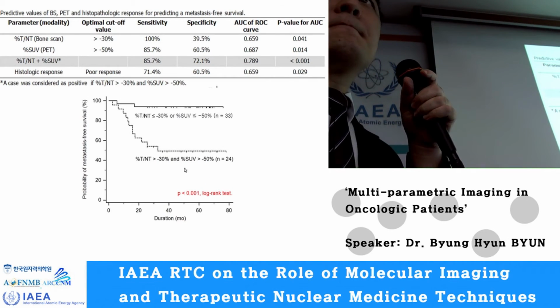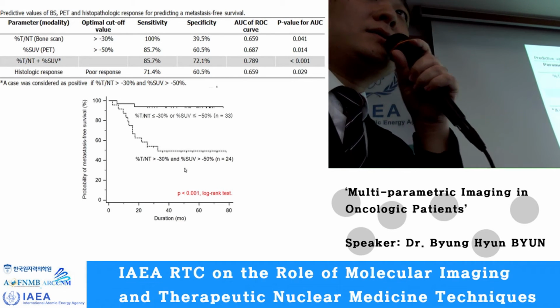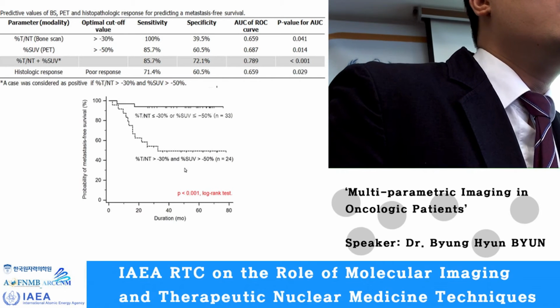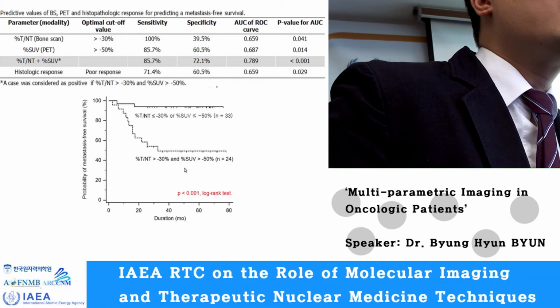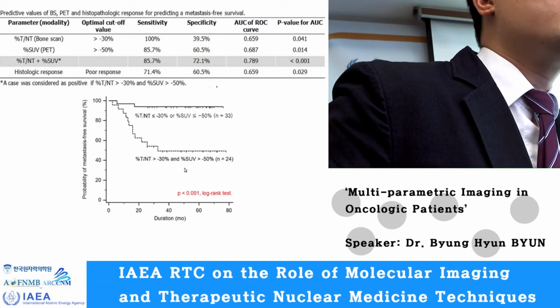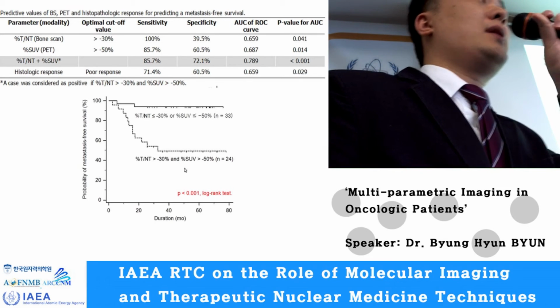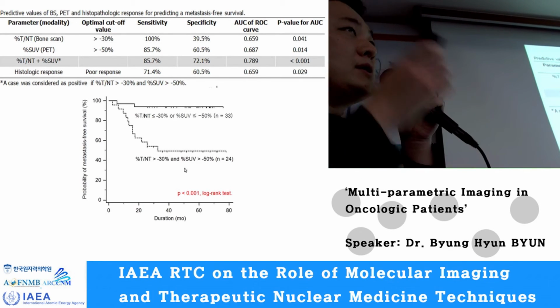We see the same phenomenon in FDG scan and bone scan. Or FDG may precede the response before the bone scan. Sure. Yeah. Right.